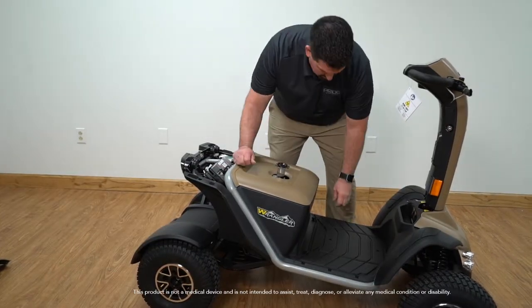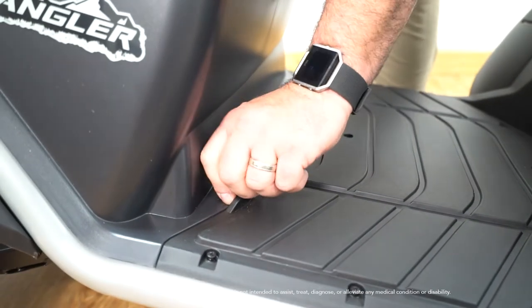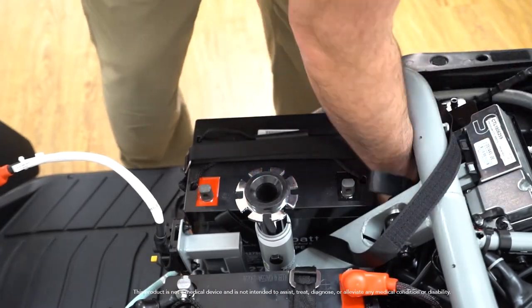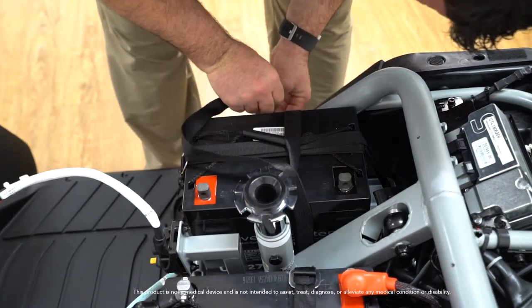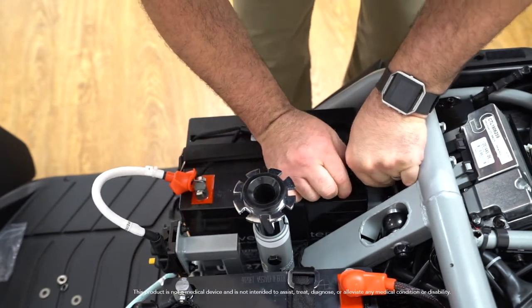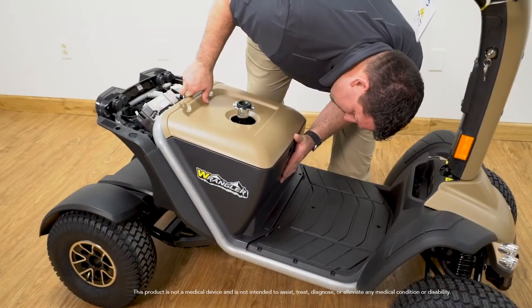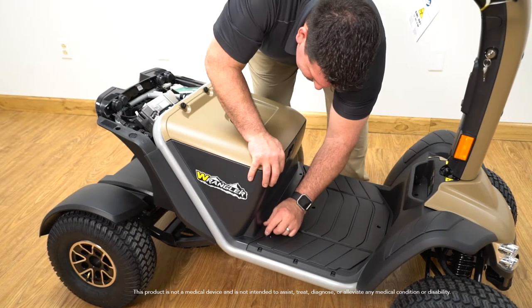Start by removing the yellow screws that hold the rear shroud in place. Then remove the battery cover shroud by removing the black screws. Be careful when lifting the battery shroud over the seat post so you do not damage the circuit breaker while lifting and replacing. Next, connect the batteries to the unit. Use the instructions provided on how to strap the batteries down — strap down the batteries width and length, then connect the positive and negative terminals. Turn the key to the on position to make sure you have power to the unit. After testing for power, replace the battery shroud and rear shroud. Remember to be careful not to damage the circuit breaker when attaching the battery shroud.